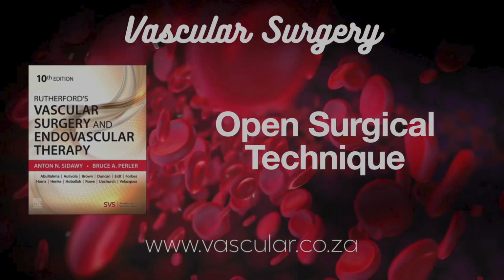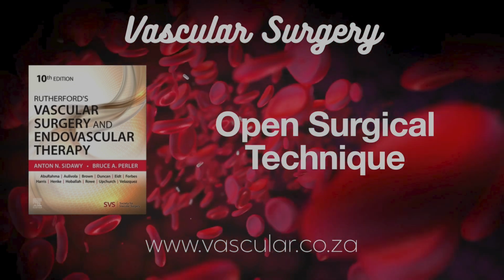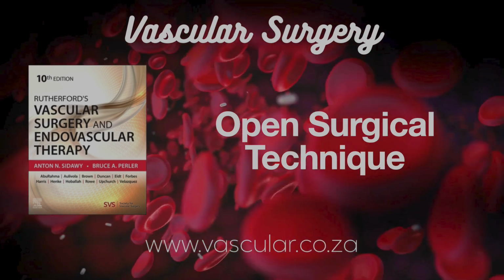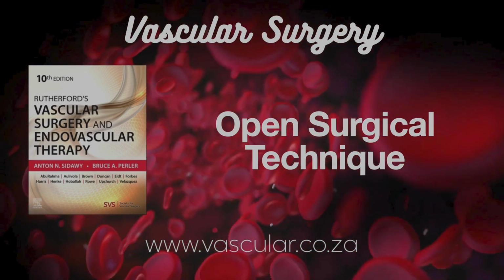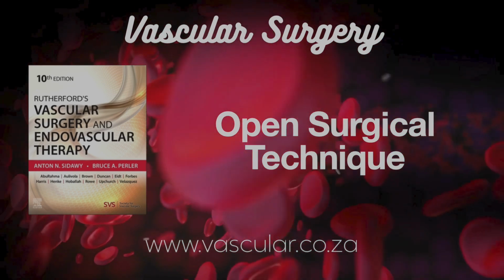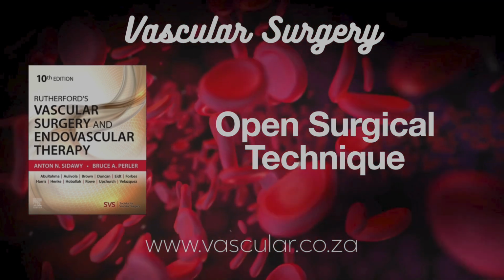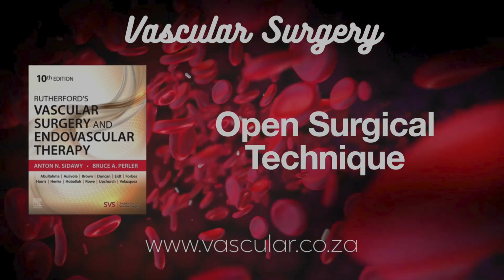Right. Okay. Control established. Let's move to repairs. Thromboembolectomy, removing clots. Sounds vital. Absolutely fundamental skill, often the key treatment for acute limb ischemia, sudden blockage. How does it work? Basically, you use a specialized balloon catheter. A Fogarty catheter is the classic example to physically pull the clot out of the artery.